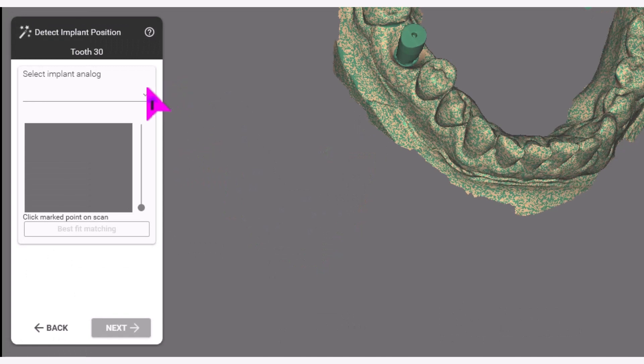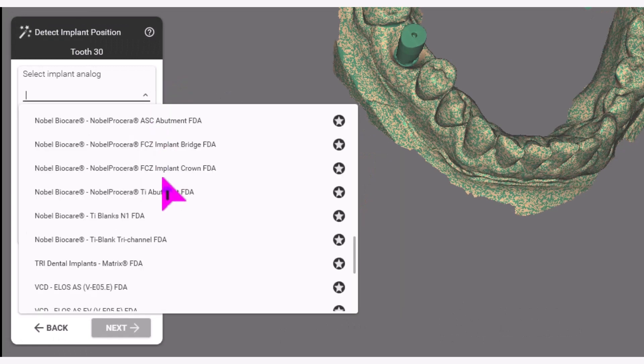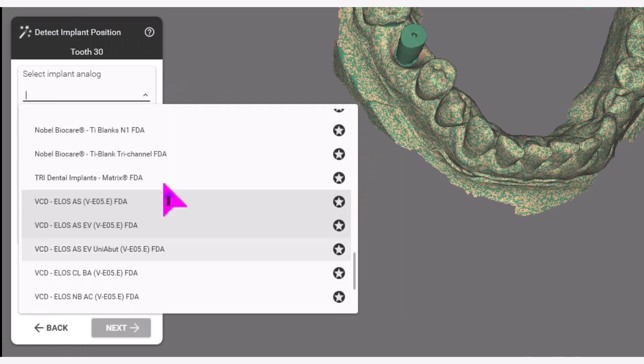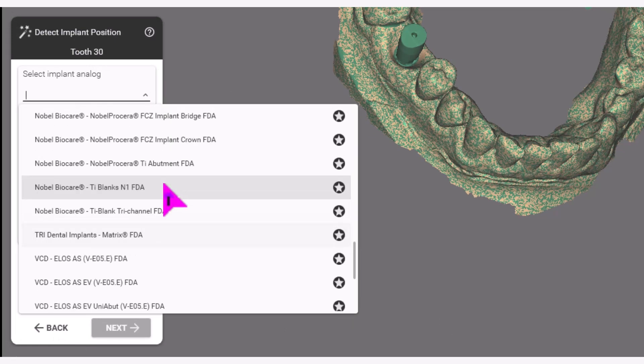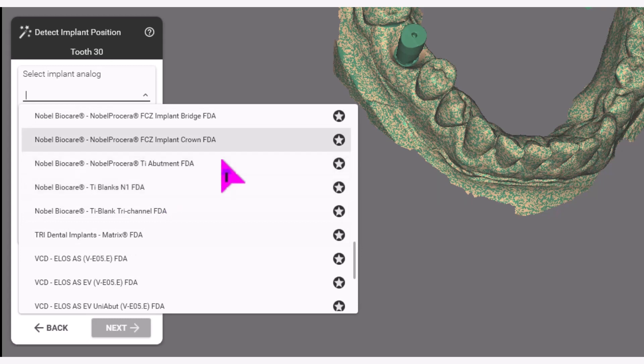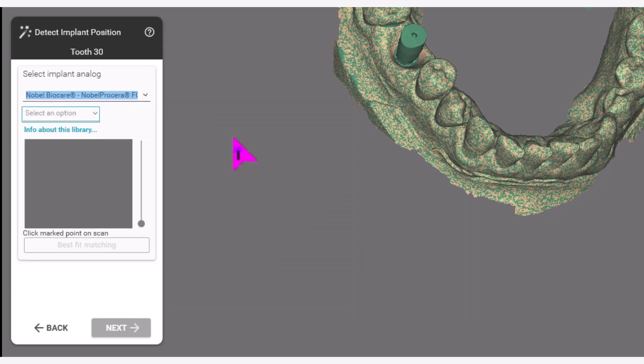First, select the restoration type. In this example, we will be doing a Novo BioCare Novo Procera FCZ Implant Crown FDA.